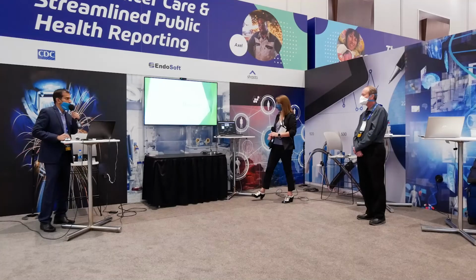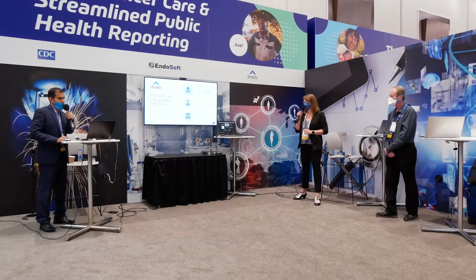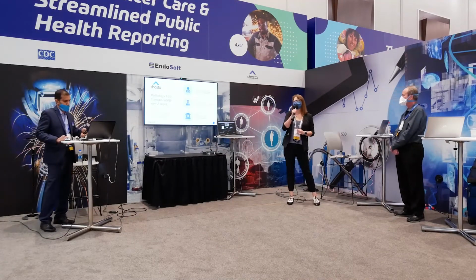Axel now completes his first stage of diagnosis, and he is asked to come back by the physician for a follow-up visit in a week or two when the result is available back from the pathology lab. Let's pass over to Shasta and see what is happening with the HL7 message that was sent over to the lab. Thank you, Shiju. Good afternoon.